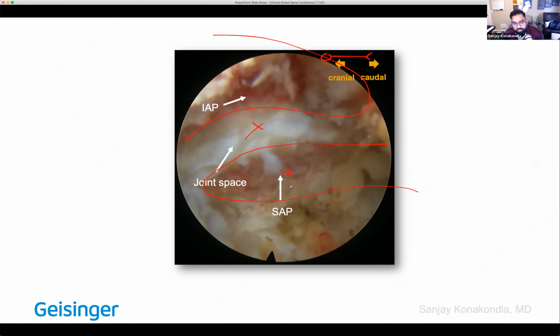And this way, whether you have intraoperative navigation or fluoroscopy or intraoperative CT, you have many ways to confirm what you're looking at. Obviously, as an exercise, you like to predict what you're looking at before you take any picture, because you're using it as a confirmatory test rather than learning throughout the case.